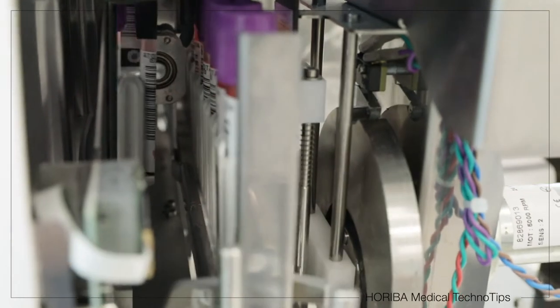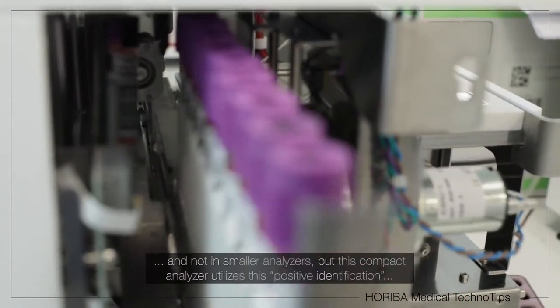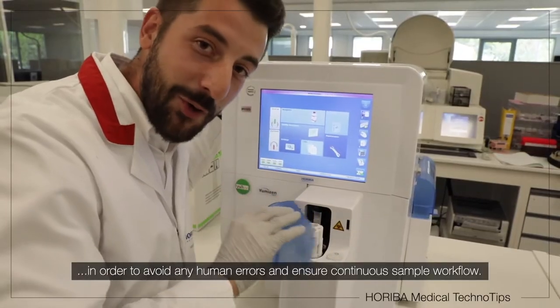This positive identification, usually implemented in a high-range workflow, is applied to a small analyzer in order to avoid any human mistake and secure the sample workflow.